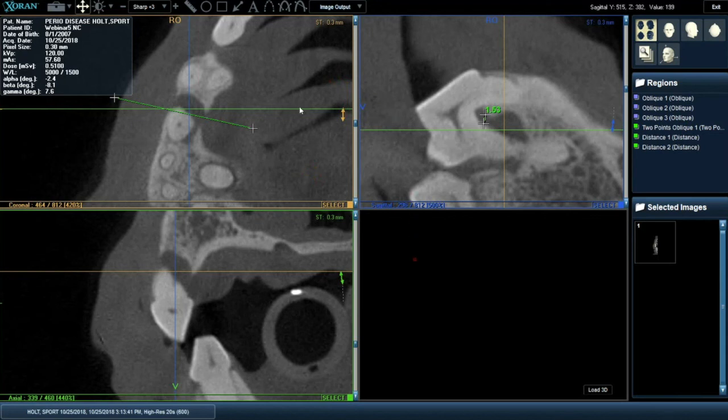David, I have a question. It's Mary Hernandez. Hello, Mary. Hi. One of the things is, in practice, are most people doing the cone beam CT and then having them come back for the procedure?